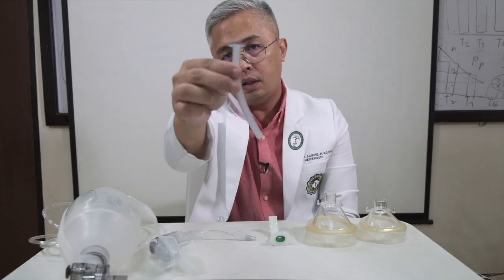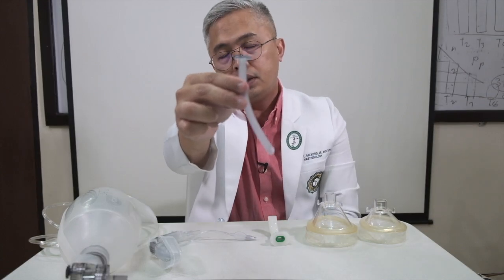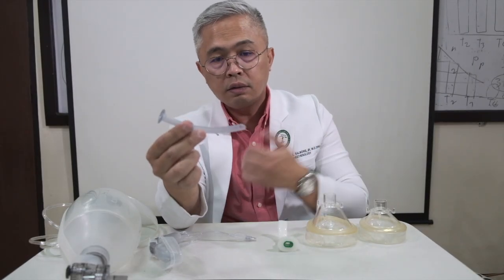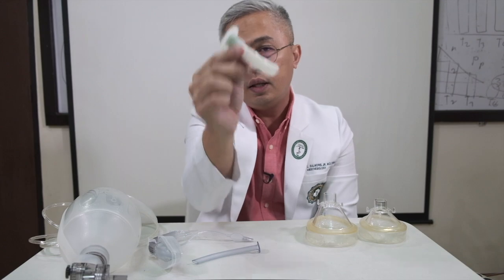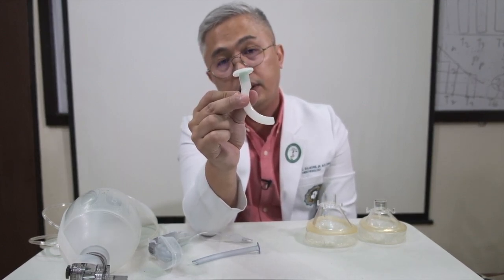Next is another option, the nasopharyngeal airway. It's longer because it starts from the nasal area of the patient all the way to the back, the pharyngeal area, and the tongue sits on top of this one. So air goes through here, all the way there. You might want to ask which one to use. You could use either this one or this one, but this is the most common adjunct that we use in the operating theaters.